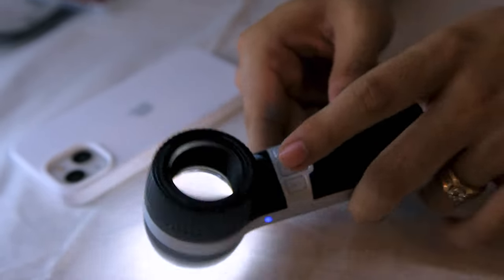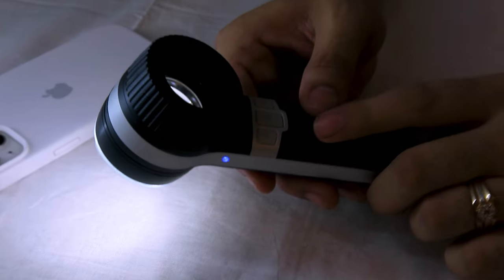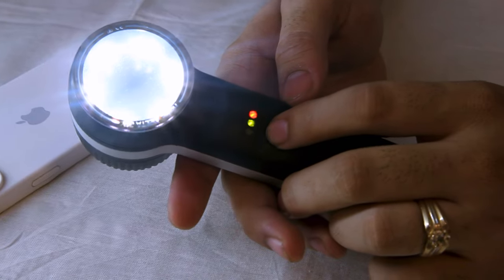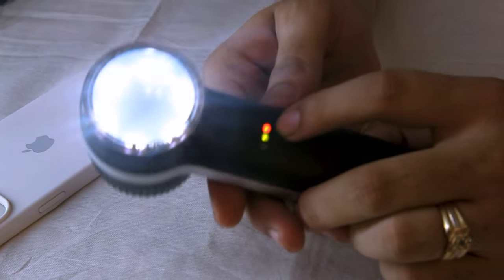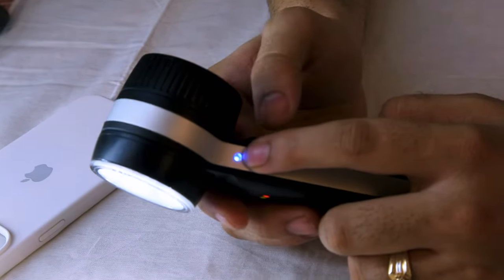As you can see, the light changes when you use the polarized button — the object becomes clearer. Now regarding the charging indicator: the first indicator is 100 to 60 percent charging, the second is 60 to 30 percent charging, and the last is 30 to 0 percent charging.